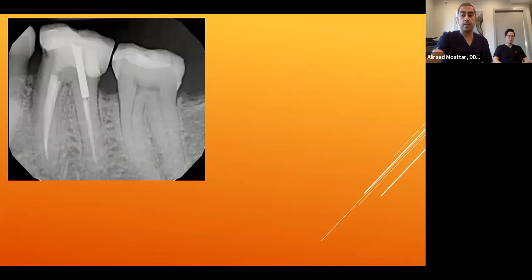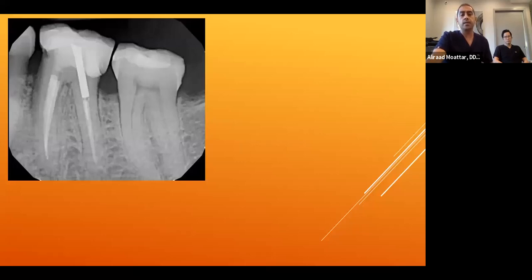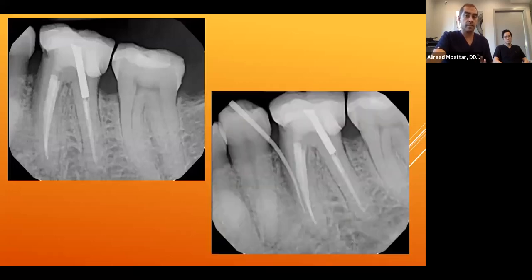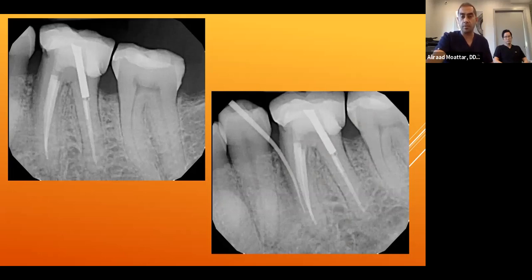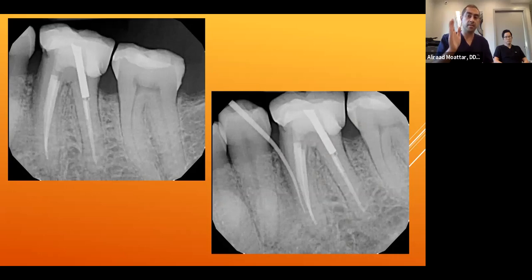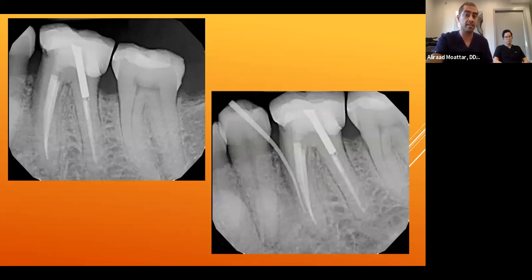Another root fracture example: a middle-aged female referred for retreatment with symptoms of biting, chewing, and a sinus tract. A great diagnostic tool for detecting fractures is tracing the sinus tract with gutta-percha. Usually with a periapical lesion, gutta-percha points to the apex, but in this case it pointed almost to the middle of the root — indicating this is not a periapical lesion causing the sinus tract, but most likely a fracture.